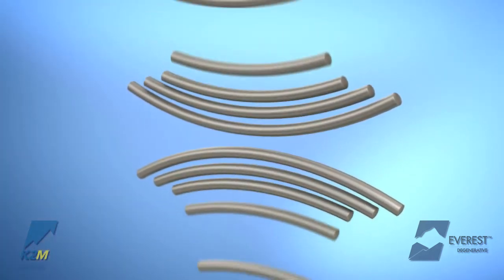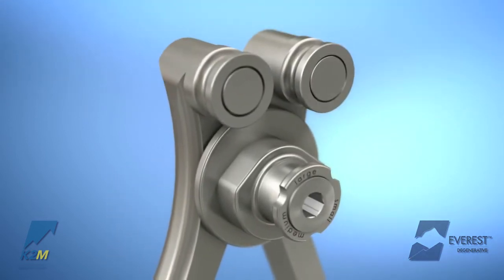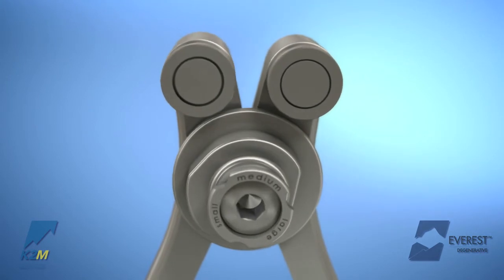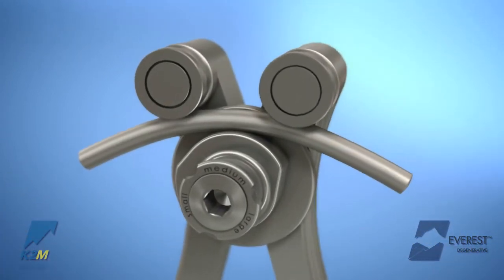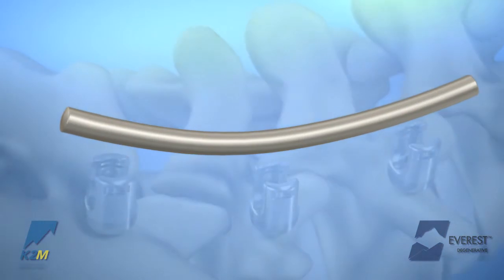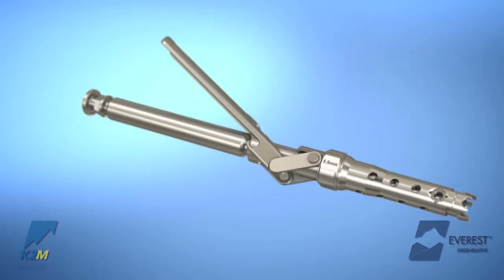Pre-contoured rods are available in several lengths in both 5.5 and 6.0 mm diameters. The French rod bender may be used to contour the rods to the desired amount of lordosis or kyphosis. By pulling out and rotating the dial, the rod may be bent to the desired curvature — small, medium, or large. Once the desired length and contour of the rod is achieved, the rod introducing forceps can be used to fit the rod into the screws.